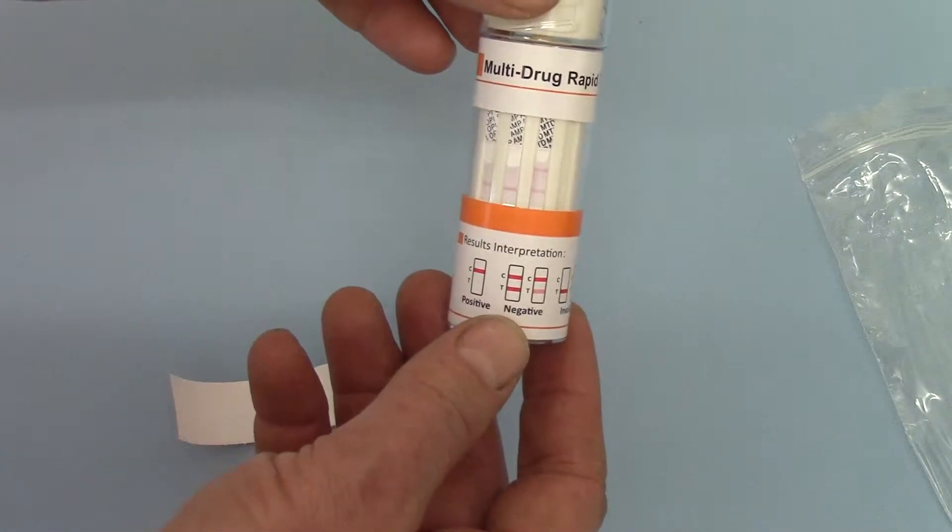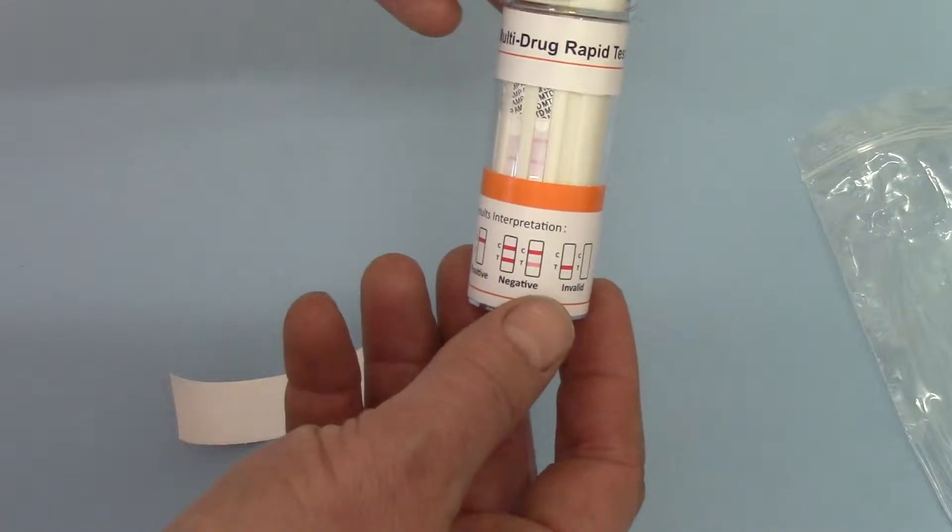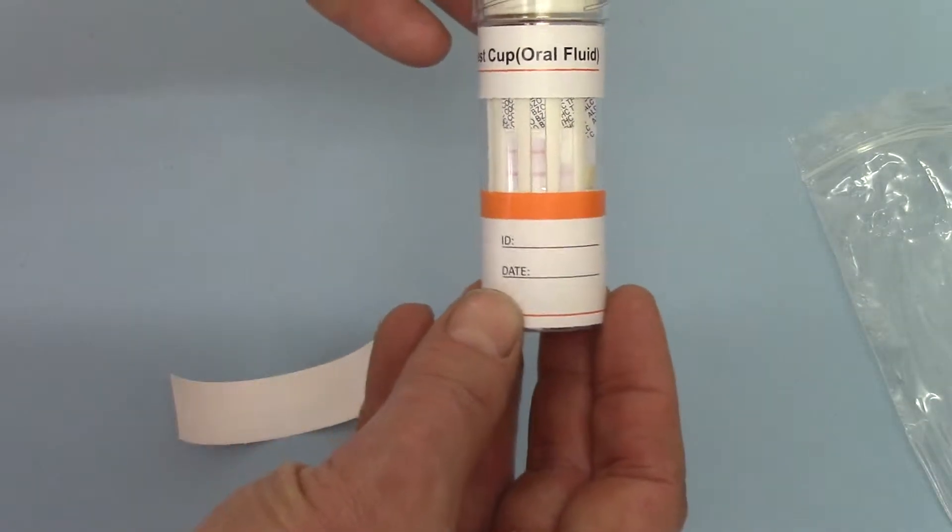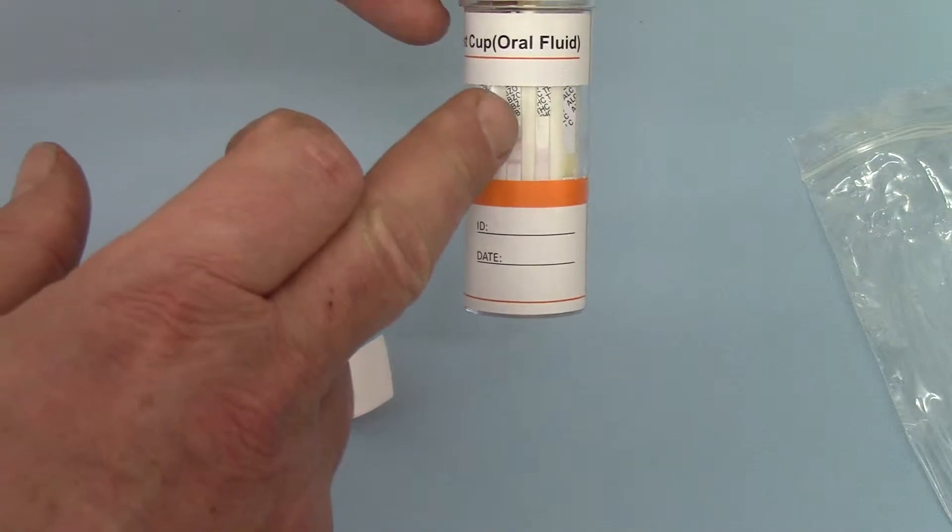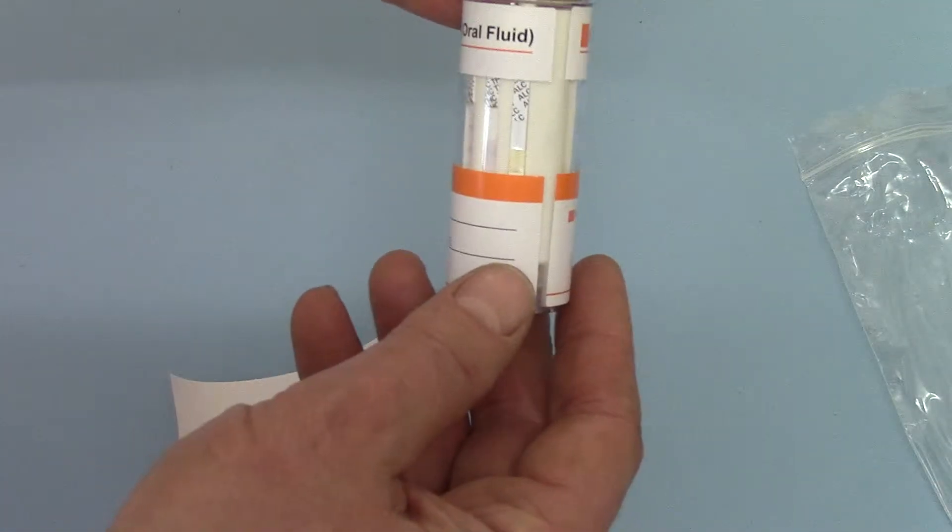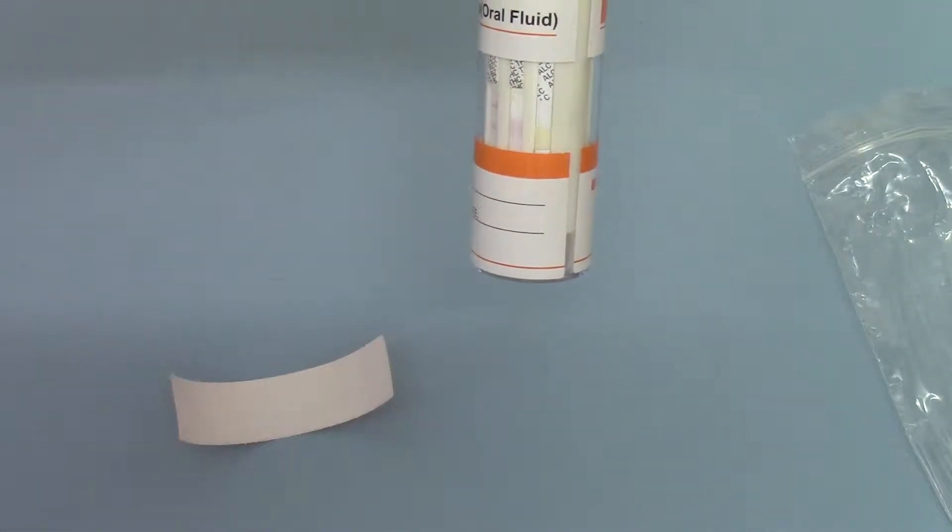So OPI for opiates, AMP for amphetamine, MTD for methadone. If we rotate round, you'll see here we have the cocaine, benzo and cannabis membranes. And on the end here, the alcohol test pad.